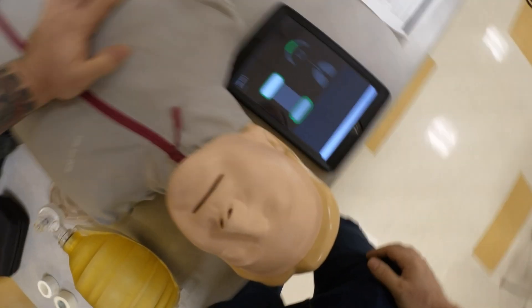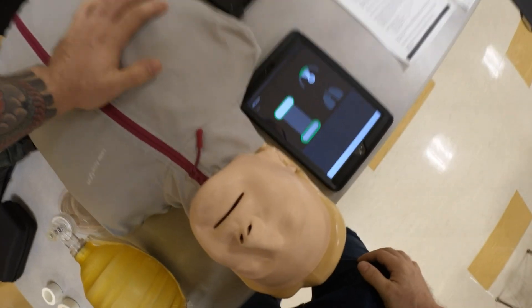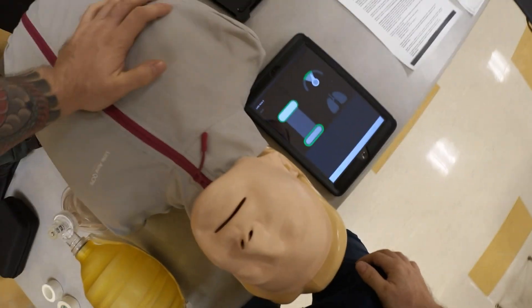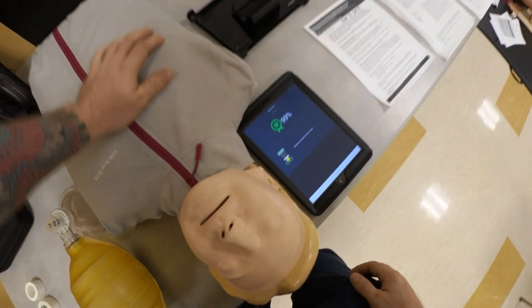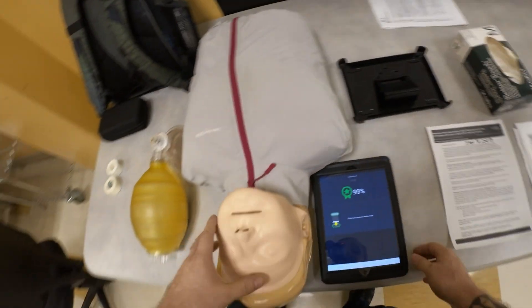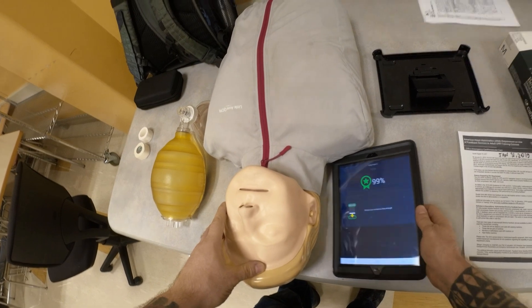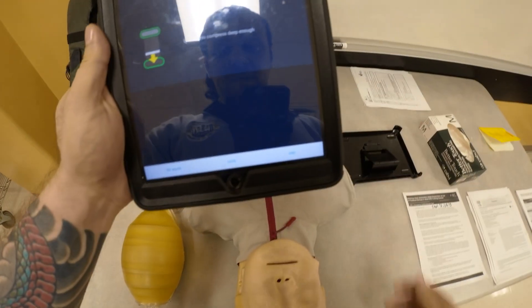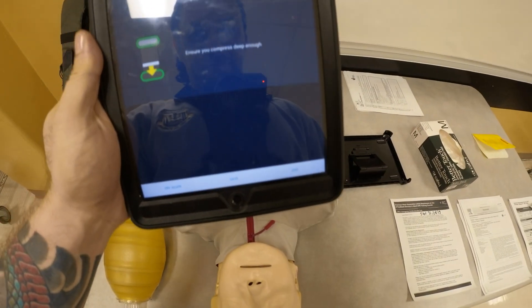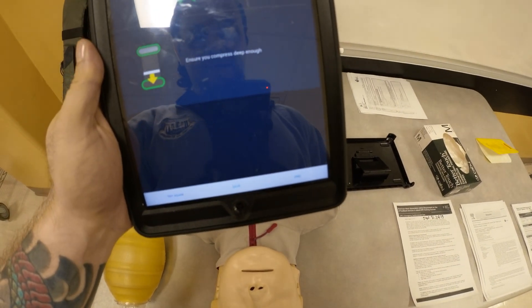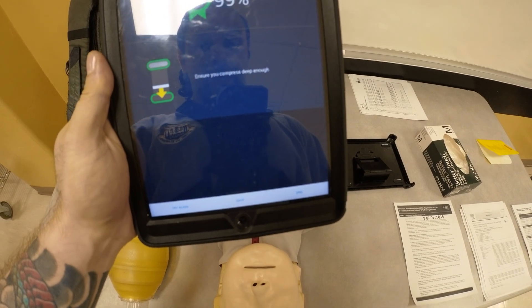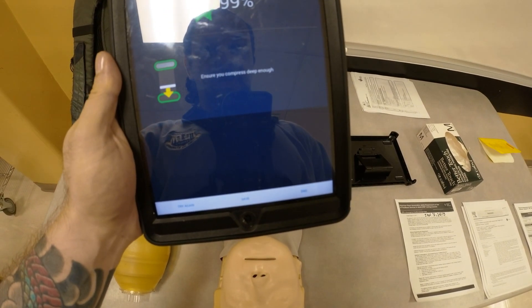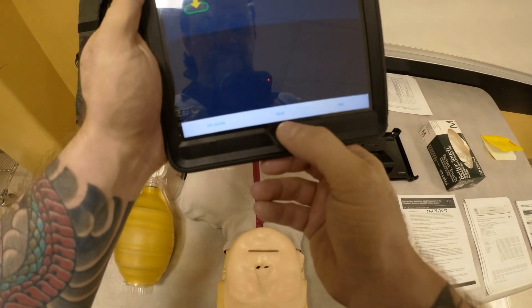Completing the final compression count. The app has stopped and we see that we have 99%, and it tells us to ensure compression depth.